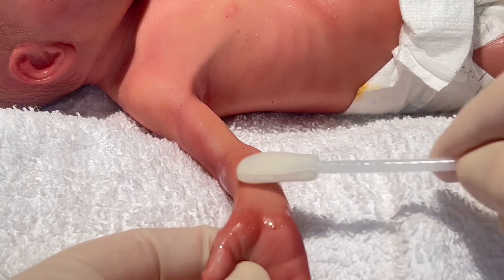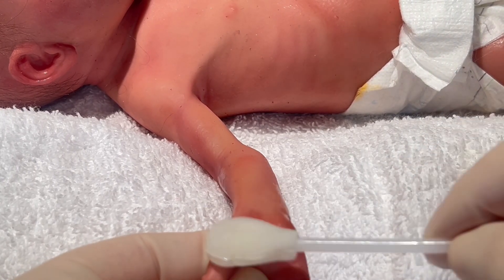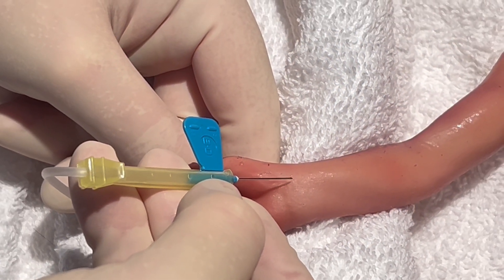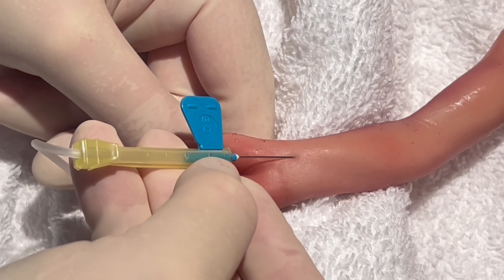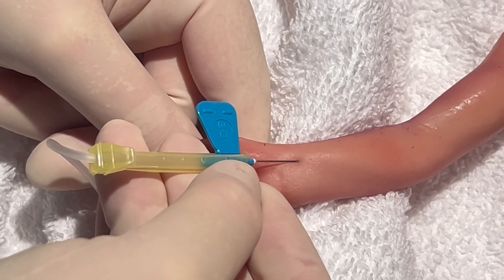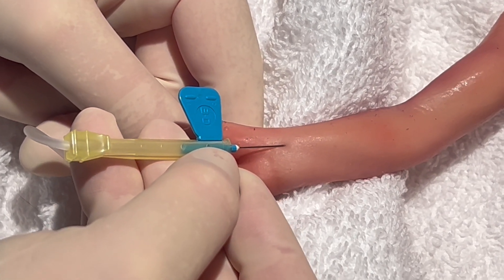At this point, you can cleanse your site per unit protocol with items such as alcohol, chloroprep, or povidone iodine. With the bevel of the needle up, position the needle against arterial blood flow. Enter the skin first at a 15 to 30 degree angle, and you may need to reposition to a 45 degree angle for deeper arteries.